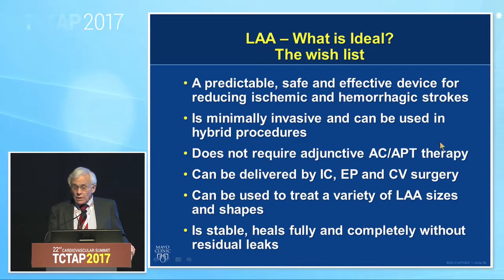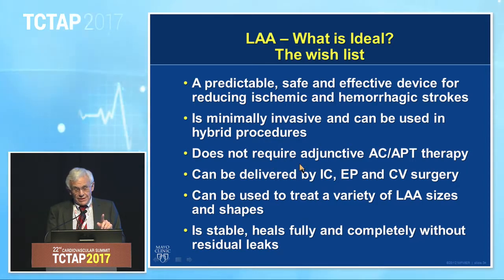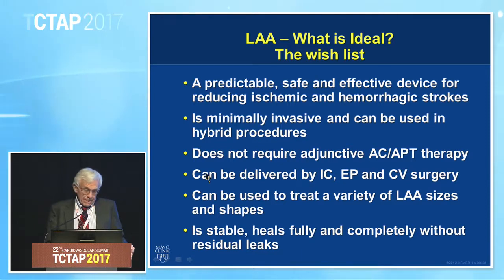It does not require adjunctive anticoagulant therapy. We have that. Can be delivered by cardiology and EP and cardiovascular surgery. And we have those technologies, those approaches, and so we've been able to achieve that. Can be used to treat a variety of left atrial appendage sizes and shapes. We're working on that.